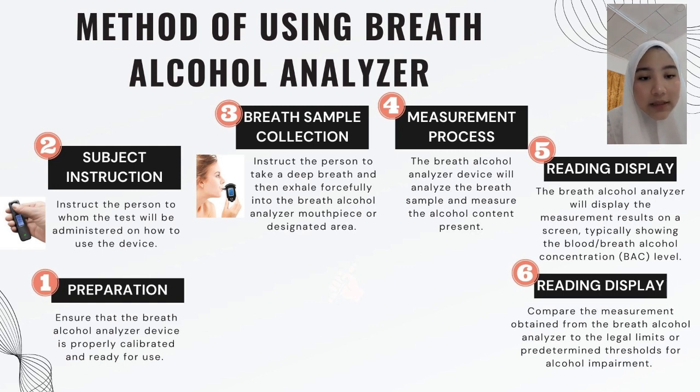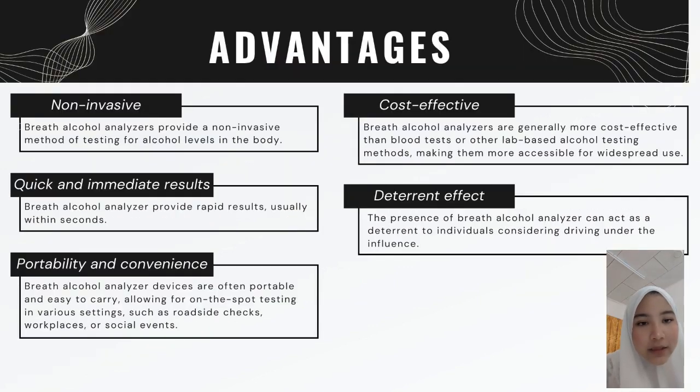So the next is reading display. The breath alcohol analyzer will display the measurement results on a screen, typically showing the blood or breath alcohol concentration (BAC) level.